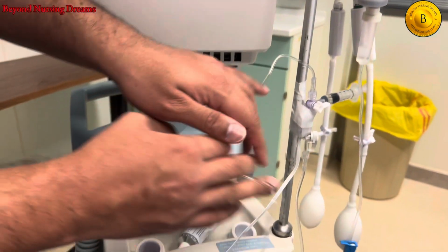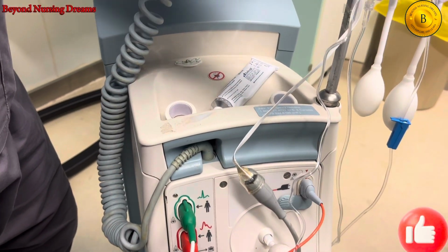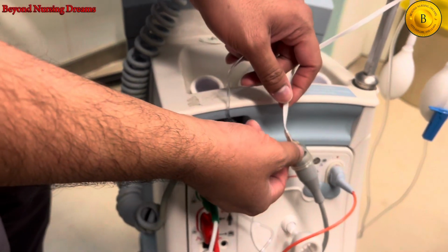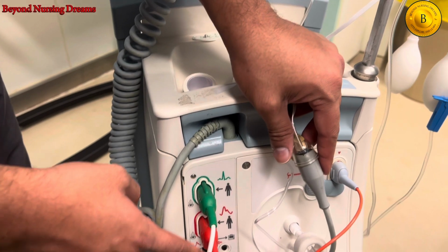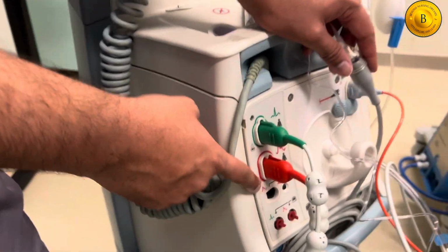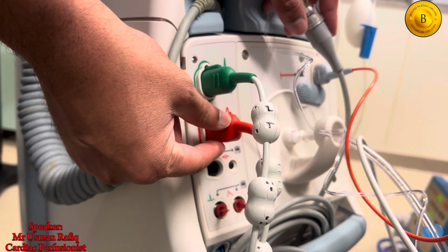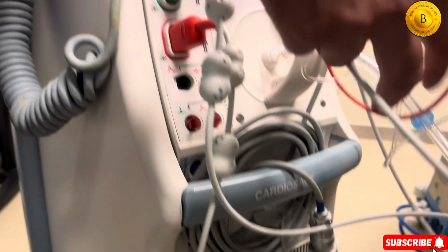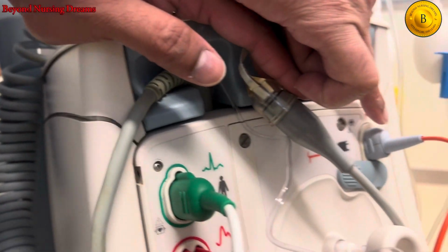The other line we connect with the end of the catheter in the patient, the IBP side. So we connect the transducer with the pressure line of the intra-aortic balloon pump machine. The red one is the pressure line cable, the green one is the ECG cable, and this one is the helium line we are connecting here. This one is our fiber optic cable.